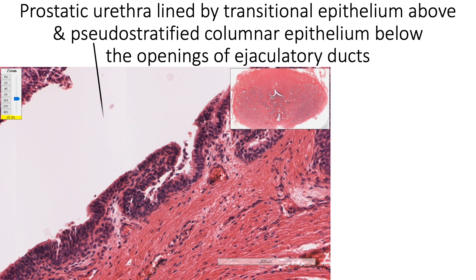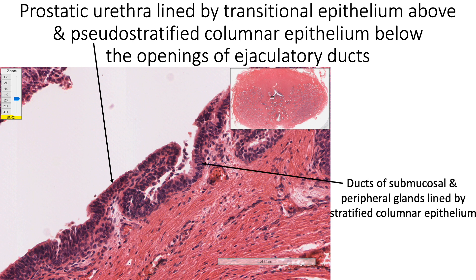The prostatic urethra is lined by transitional epithelium above the level of the openings of the ejaculatory ducts, and by pseudostratified columnar epithelium below that level. The ducts of submucosal and peripheral glands are lined by stratified columnar epithelium, with a basal layer of cuboidal cells and a luminal layer of columnar cells.